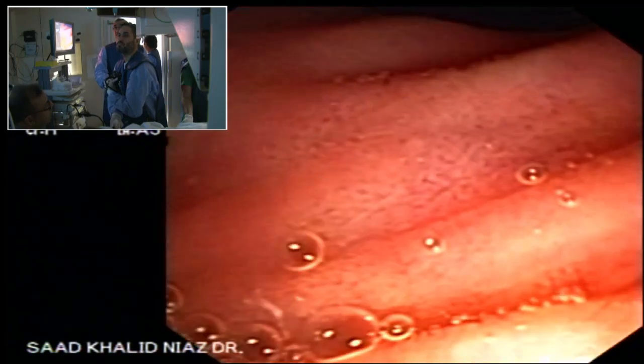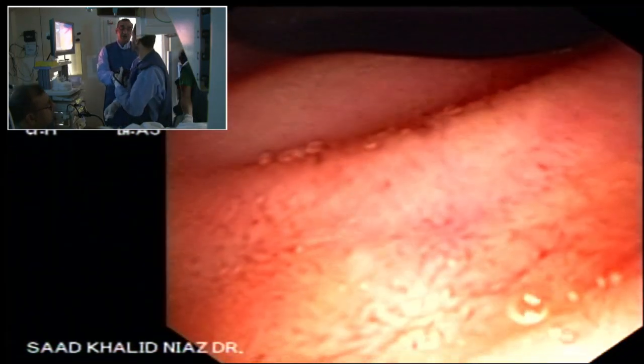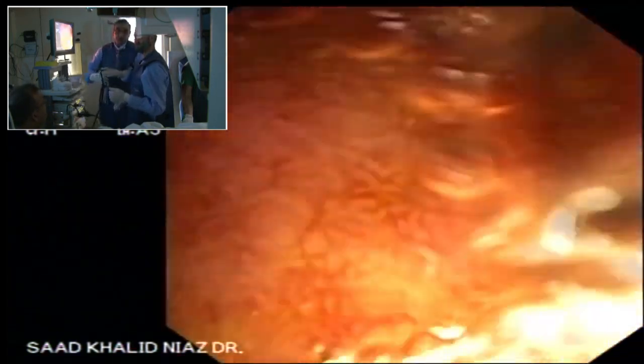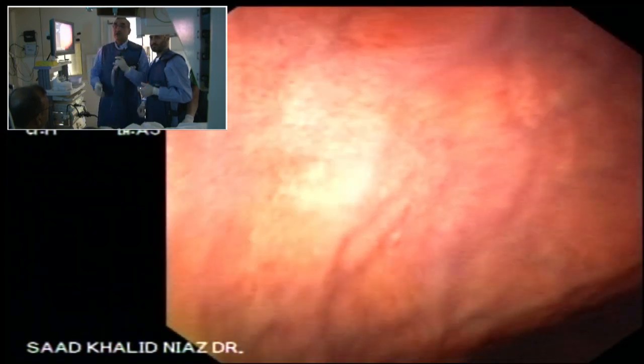No, just a second. Just calm down, right? Don't go into such an extreme position. The scope is turned like that, you are twisted yourself. Always look comfortable and nice as the scope is. You can't do an ERCP with a scope like that, or you can cause damage there. It is locked, it shouldn't be locked, right? All the knobs should be relaxed. Just a second. You can't do an ERCP with a scope like that. It is impossible. Trust me, right?